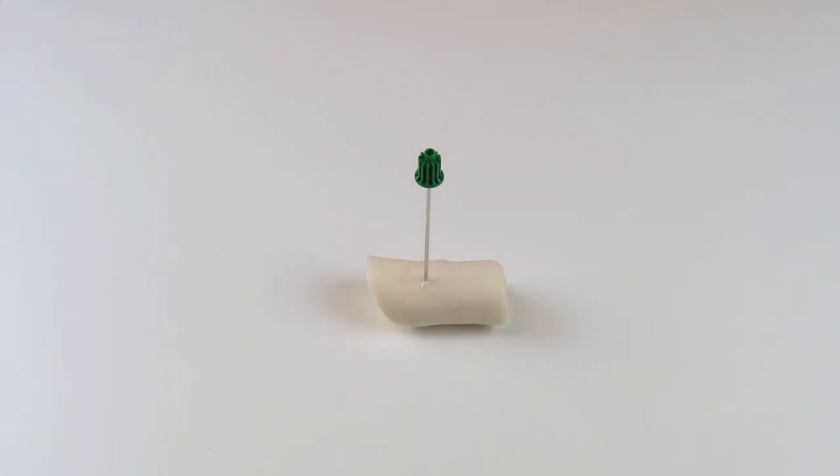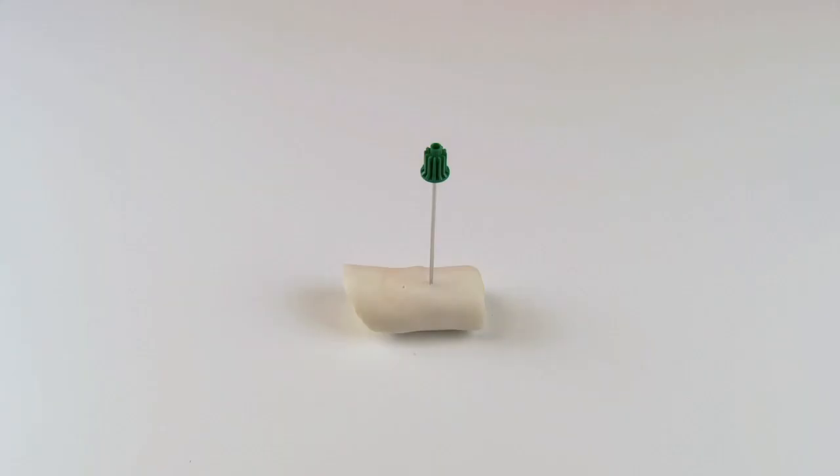The anchored cannula now provides a passage for the desired intervention, such as an ablation, injection, or biopsy. Now we will perform a biopsy. The biopsy needle is designed for successful sampling of somewhat sclerotic lesions. More lytic lesions are also possible to sample by using a syringe pressed onto the lower fitting. For increased accuracy and precision during sampling, use of the depth gauge is recommended.